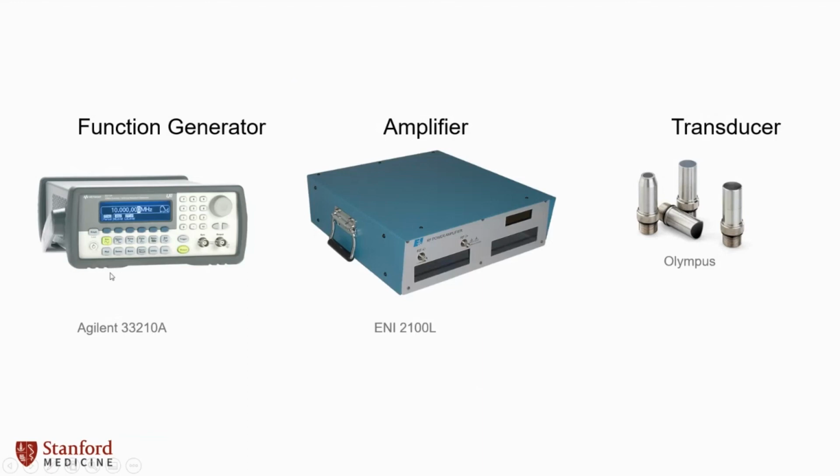So for me, I've always used that to basically control experiments. I just hit play, and then it may change the features of ultrasound. It may increment up intensity or change pulsing frequencies, stuff like that. It's really good to work with. I'd be happy to share the software for controlling this that I've written as well.